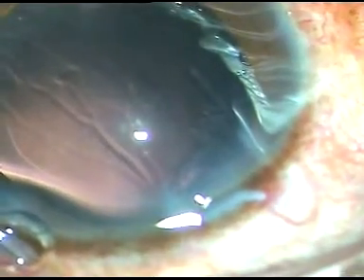I come out while I emulsify the last fragment. Leakage from the side port stops. The posterior capsule goes backward and there is no chance of catching the posterior capsule.